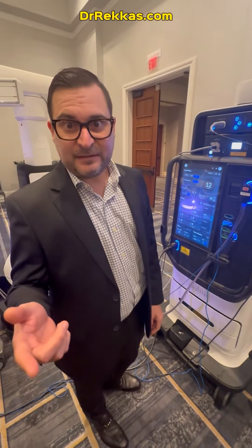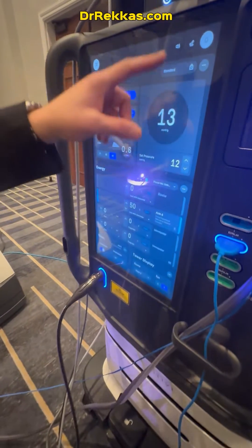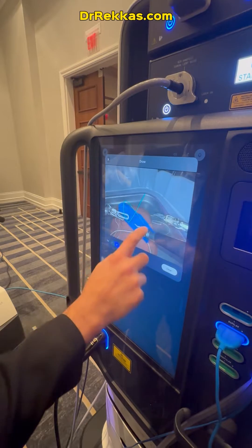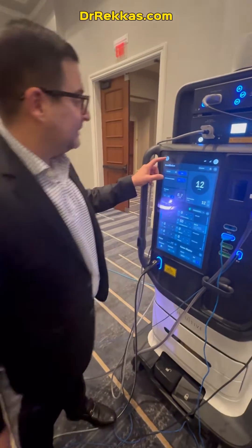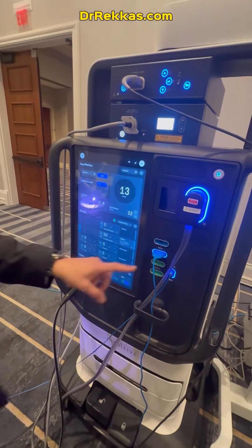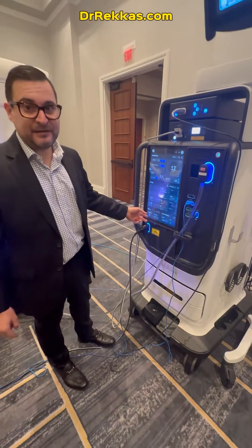This is the new tower on the DaVinci 5. It has insufflation, it has energy in watts as a tower display. And you can even draw on here, so when you're trying to teach other surgeons you can point things out. Really, this is kind of a state-of-the-art huge upgrade with an additional camera, insufflation with smoke evacuation — a lot of upgrades on this system.